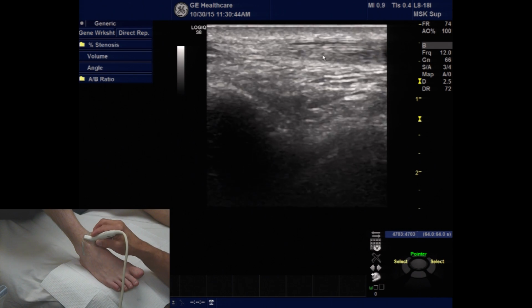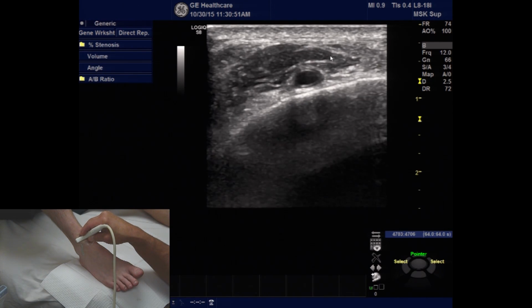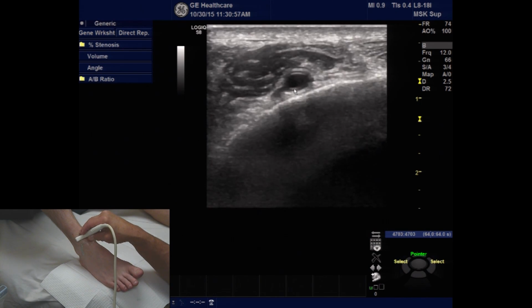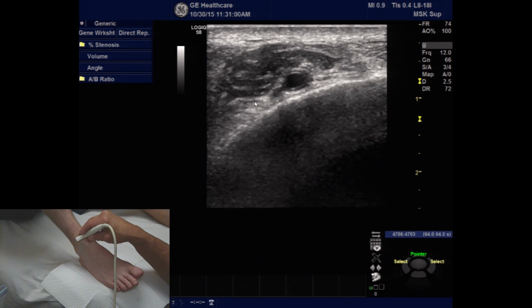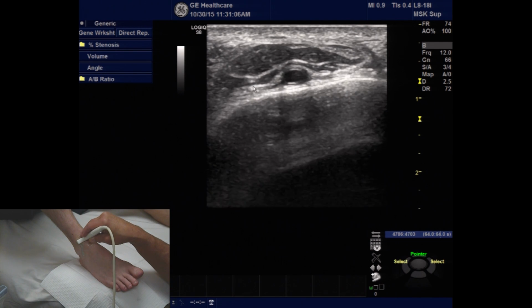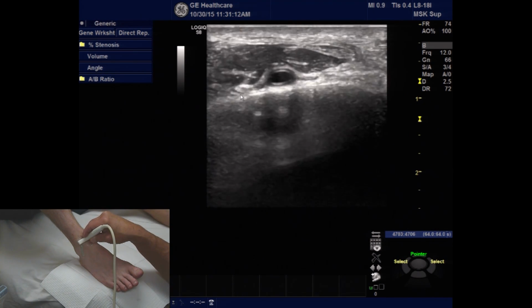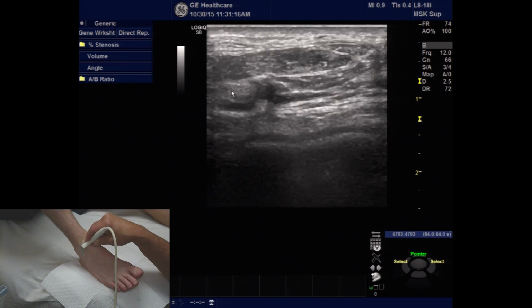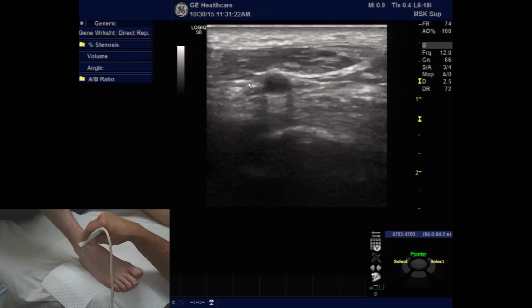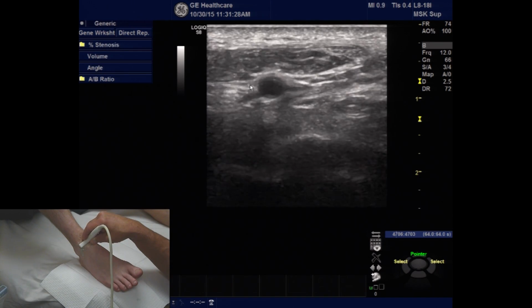Turning the transducer back into the short axis again, we're going to look slightly deep to the extensor hallucis, and we're going to see the dorsalis pedis artery. Just adjacent to the dorsalis pedis artery, we're going to see the deep peroneal nerve. The nerve will have its typical structure of a circular structure with hypoechoic areas in it, and if we move the transducer inferiorly, the deep peroneal nerve is going to cross over the top of the dorsalis pedis and move on to the medial aspect. By going back and forth, we'll see the nerve cross over, and then it comes back to its more lateral position.